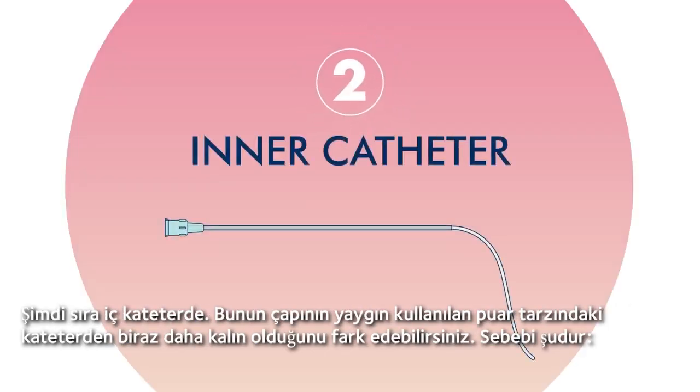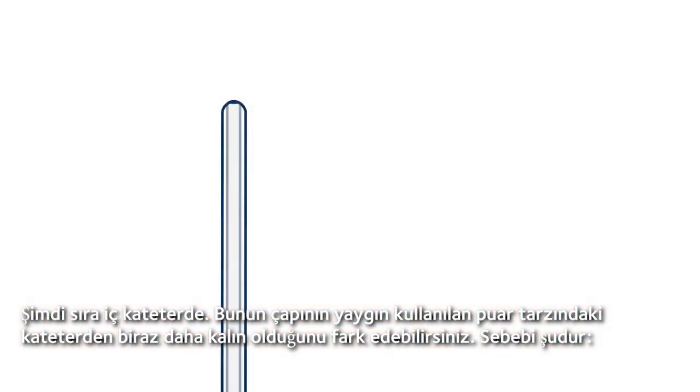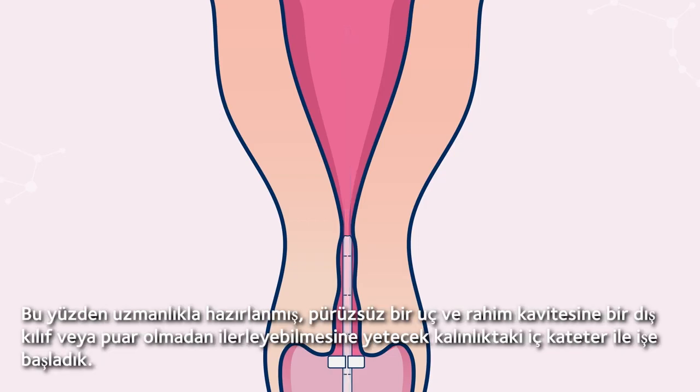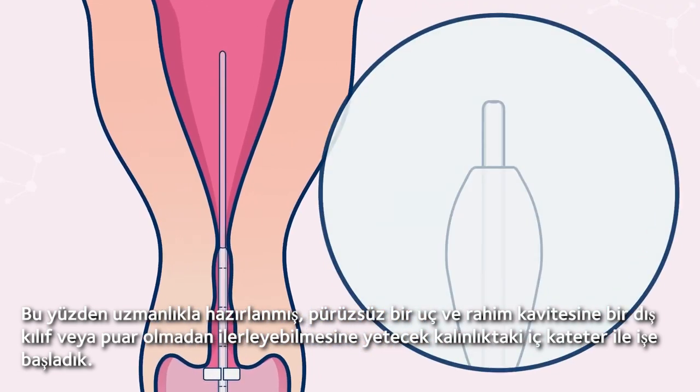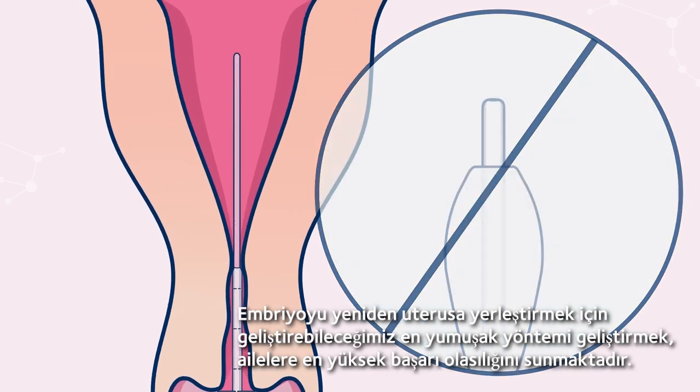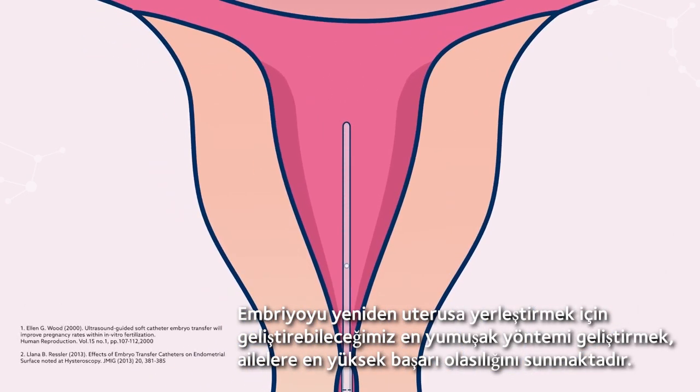Now for the inner catheter. You may notice it's ever so slightly thicker in diameter compared to a common bulb-style catheter. Our inner catheter is designed to stealthily transfer the embryo, starting with an expertly crafted smooth tip and just enough thickness to advance into the uterine cavity without an outer sheath or bulb. We believe that creating the softest method to place the embryo back into the uterus gives families the best chance of success.